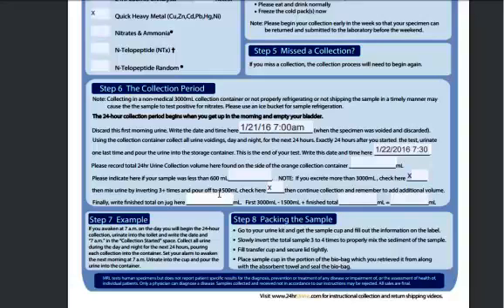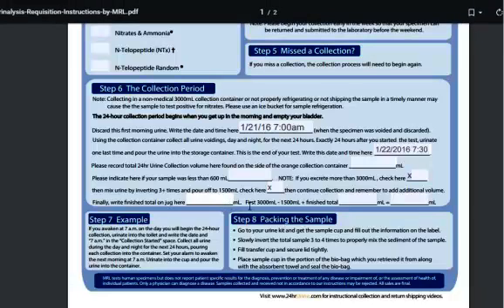Okay, so we pour it off to 1,500 milliliters. So we know 1,500 essentially is our zero. So what we're going to do to get this total, we're going to take 3,000 milliliters minus 1,500 plus the finished total. Just use a calculator. It's pretty simple. So 1,500 milliliters is a zero. So we already know we're at 3,000. Anything above that 1,500, we know we need to add that.